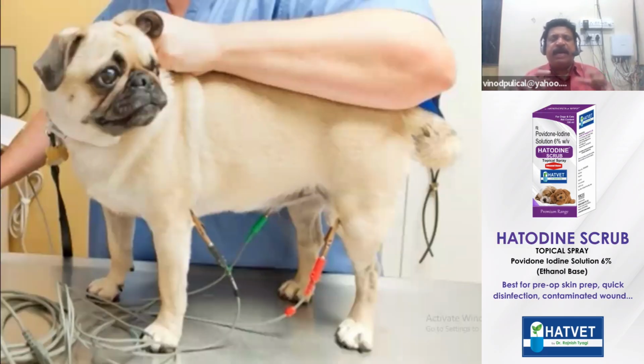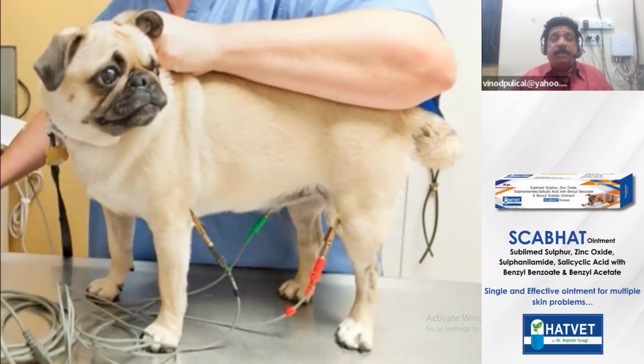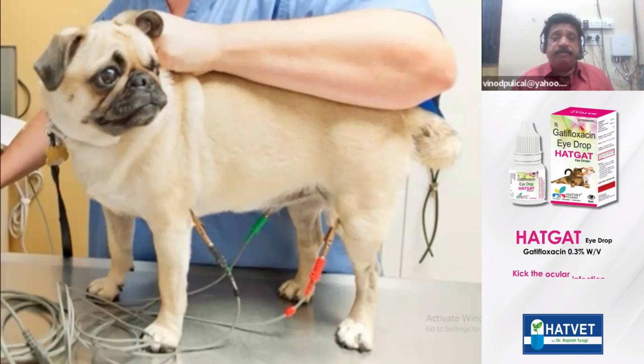Sometimes in cats, in pugs, in small breeds, if you forcefully make the pug lie down, cardiac arrest can occur. So in the pug, you can take the ECG in the standing position itself. Also in the cat, the ECG can be taken in the standing position itself.